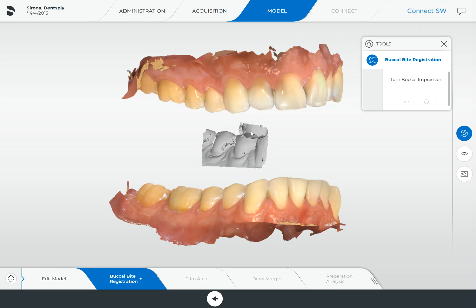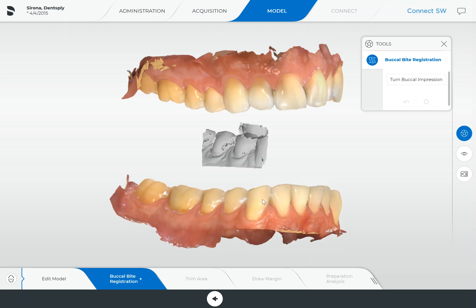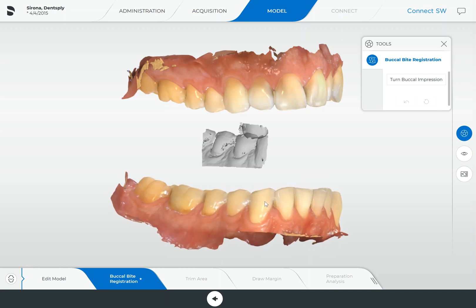The great thing is you can see we have in the gray area here a ghosting of the scan that we actually captured. You can see here that there isn't much of a scan at all — we would have wanted to scan a bit more in this area here, and we likely would have got that green check mark. But in order to do this alignment, it's very simple. All we want to do is orientate our models to look very similar to what we have here in the buccal bite ghosting scan.